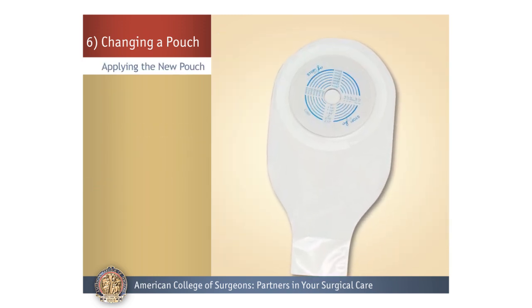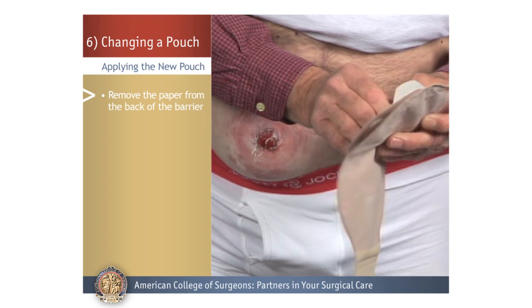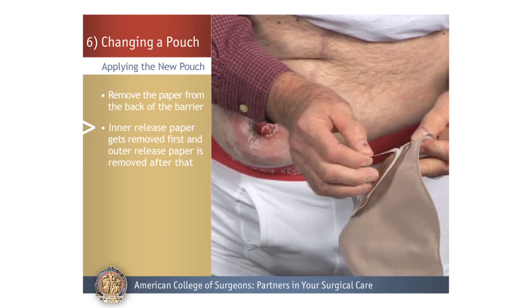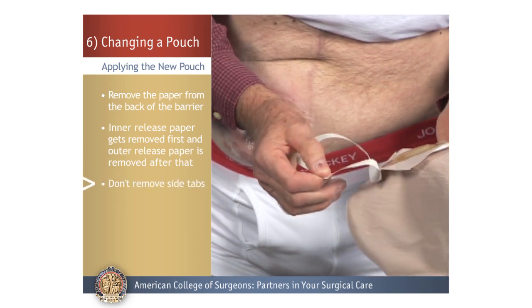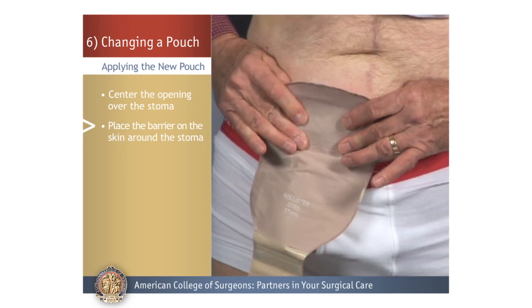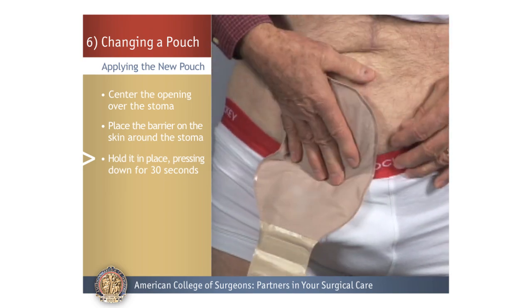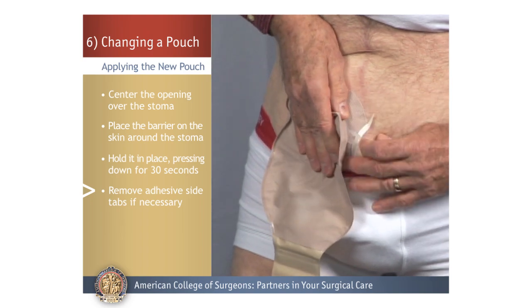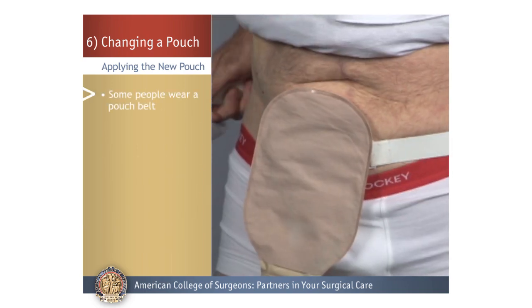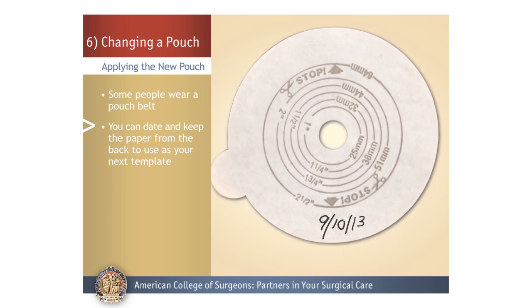Applying the New Pouch: Start by removing the paper from the adhesive back of the barrier — first the inner release paper, then the outer release paper. Do not remove the side tabs yet. Next, center the cut opening over the stoma, place the barrier on the skin, hold it in place, and press down on all sides for about 30 seconds to make sure it is firmly applied. Then remove the adhesive side tabs. Raise the bottom of the pouch and close the opening. Some people wear a pouch belt to secure the pouch. You can date and keep the paper from the back to use as your template for the next pouch change.